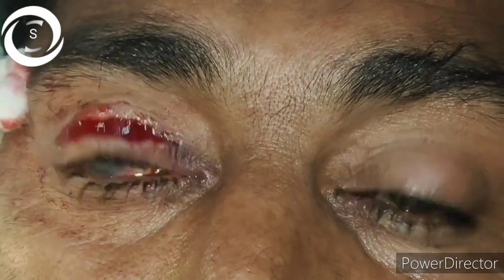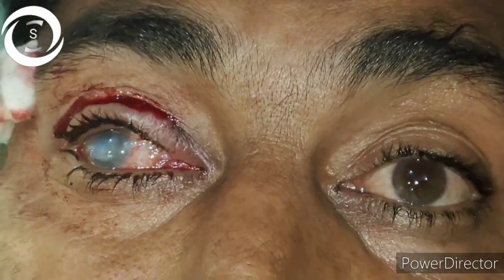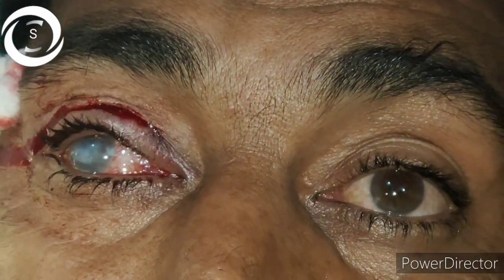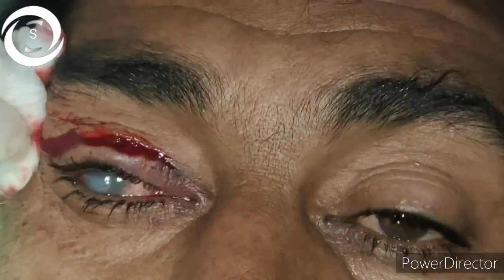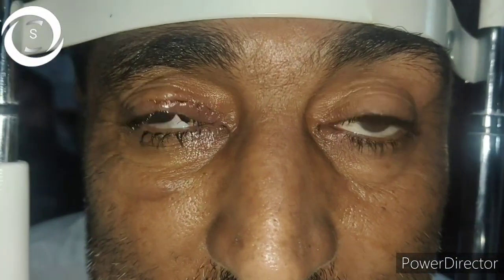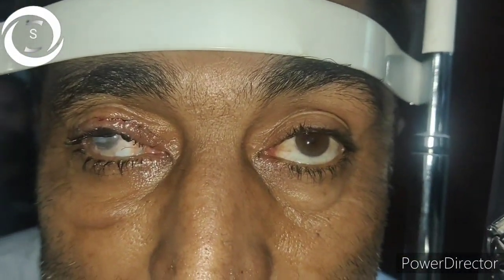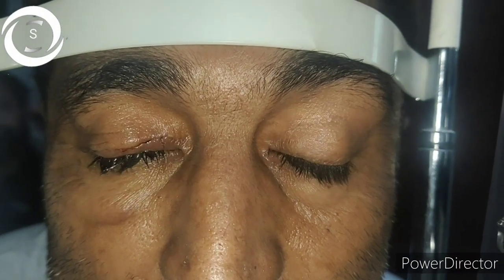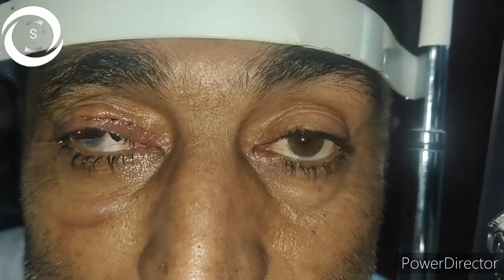With the surgical wound still open, this 50-year-old male patient presented with no perception of light vision in the right eye due to old trauma to the globe. You can see the vascularized and opacified cornea and severe ptosis, and he was more concerned about the closed lid — the ptosis — rather than the corneal appearance.